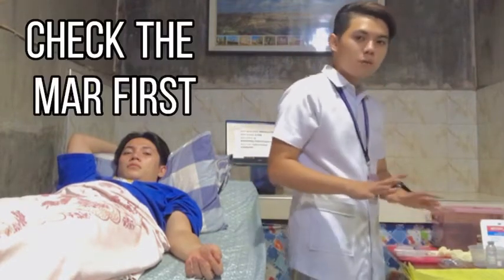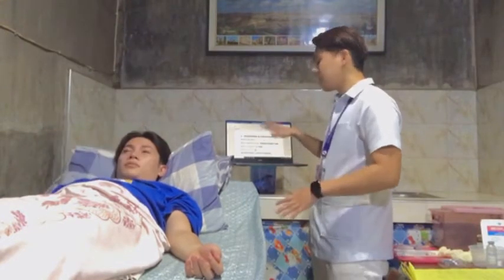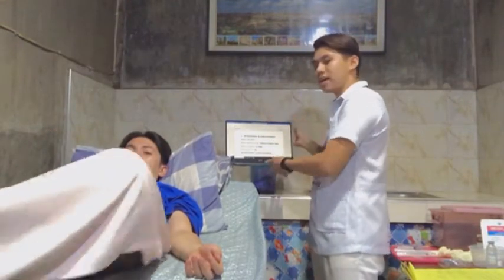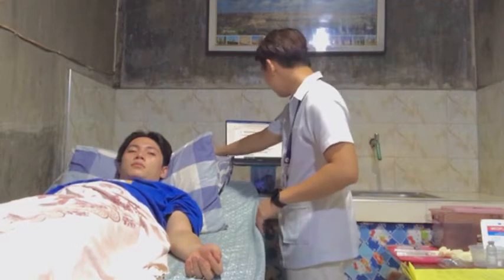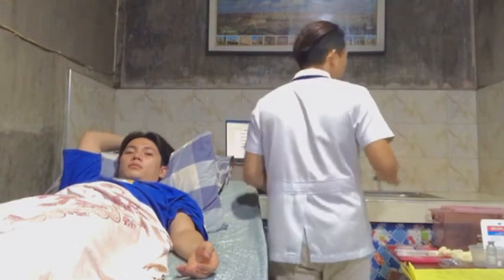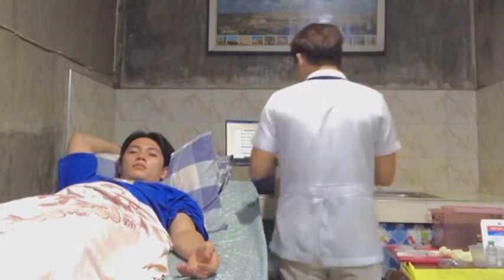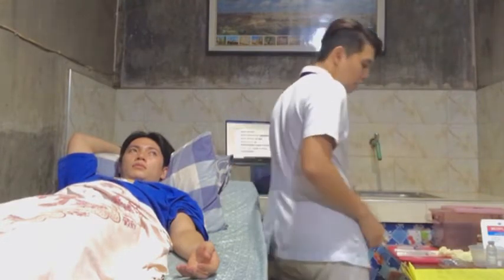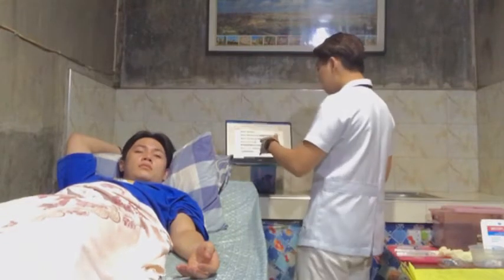So first, of course, we will be basing it on this improvised electronic medication administration record. It shows here that the right patient is Miles Ceballos. And of course, before entering the room, you must check the room number, which is 210. And the right medication for the intradermal injection is a paracetamol vial.